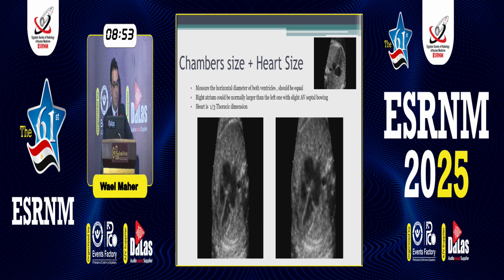Again, checking for the chamber size and the heart size, we bring the 4 chambers view. Then we take both ventricles horizontally. We assess the right side and left side. They should be symmetrical. Then we assess afterwards the cardiothoracic ratio, the transverse diameter between the atrioventricular region in relation to the maximum chest diameter. And here we can easily evaluate the cardiac dimensions.